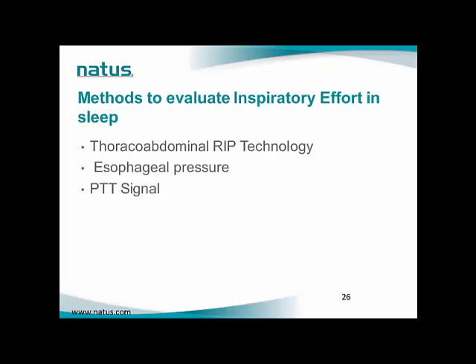The second technique is the esophageal pressure. It's considered the gold standard as it measures the fluctuations in pleural pressure. However, this technique is invasive and also expensive.